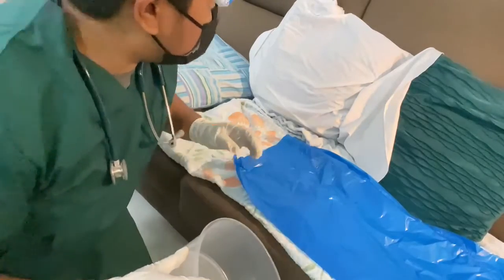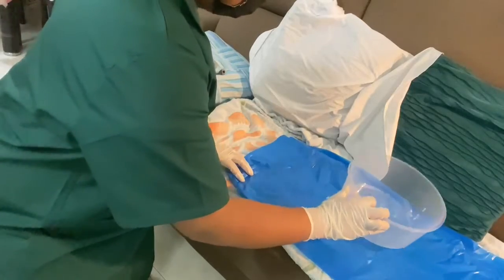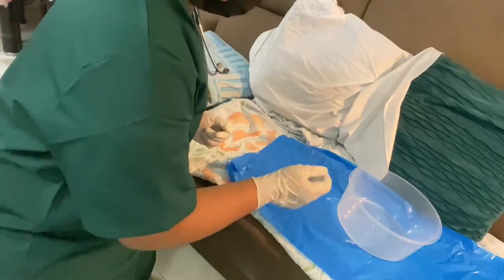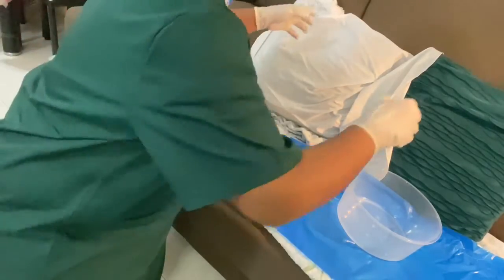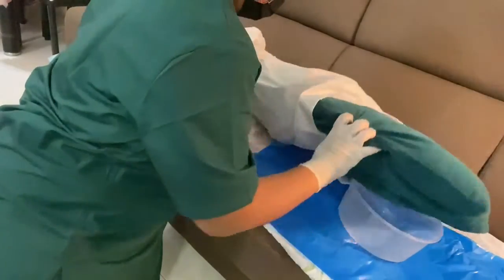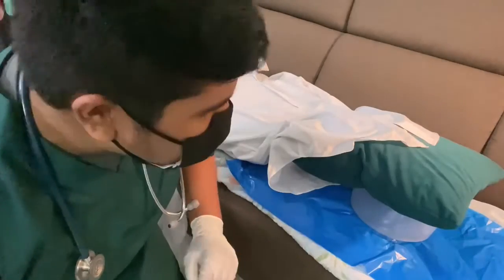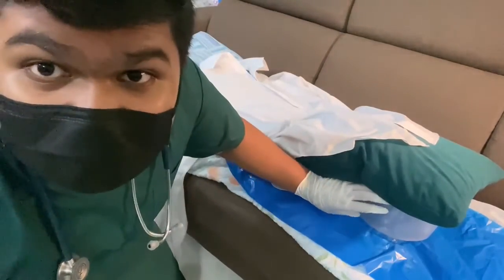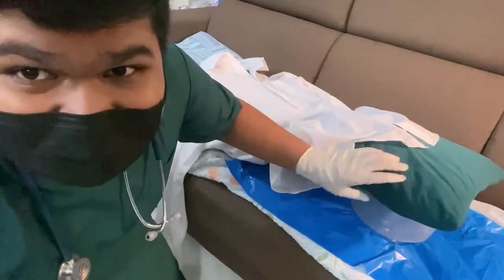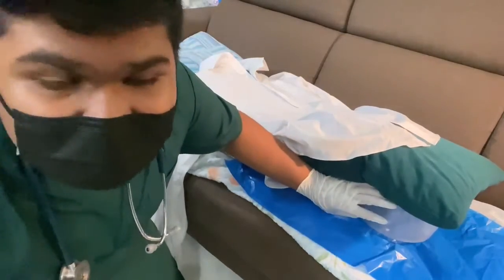Now, Mr. Elba, I will move you back into your original position with the bedpan underneath your butt. It may feel colder considering it is made out of metal, but I will aid you in this transition of your position. Now, under normal circumstances, the bedpan wouldn't be this high because it would be a very uncomfortable position, as well as the hip being in an unnatural position. But this is a Tupperware at the end of the day.